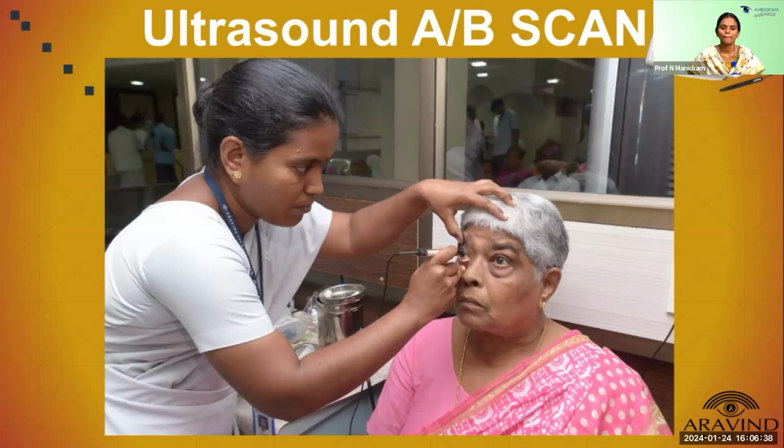A refers to the amplitude scan. B refers to brightness scan. Both scans are non-invasive diagnostic measurement tools.